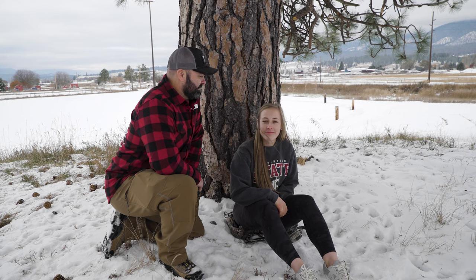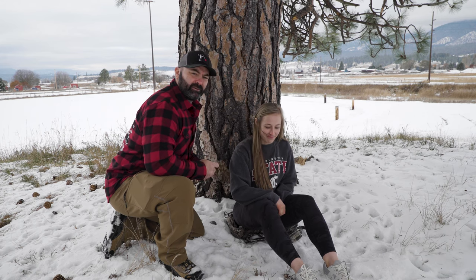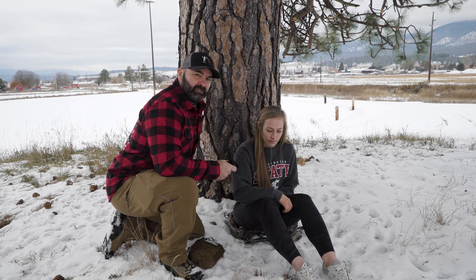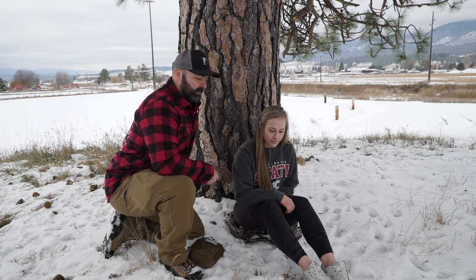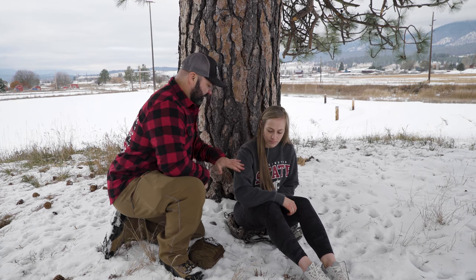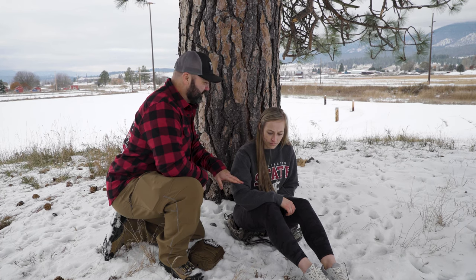We're here in the wilds of Josh Smith's front yard, and Montana Knife Company employee Melissa has brutally injured herself in this wilderness. We're going to demonstrate how to place a tourniquet on somebody's arm. Ideally, you want to use their tourniquet, not yours, because you want to keep yours for you — but in most cases that other person is not going to have a tourniquet. First we assess where the injury is. For training purposes, we're going to say it's right above the elbow here.